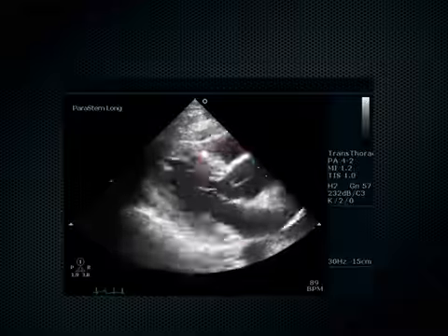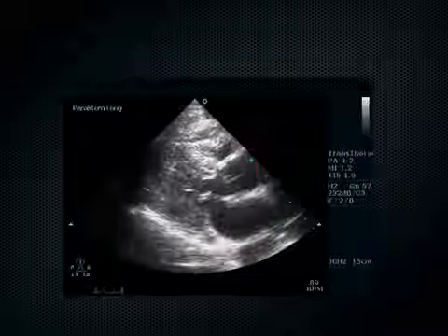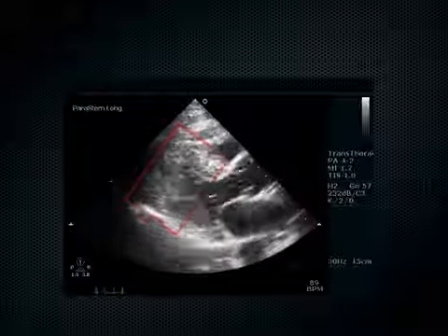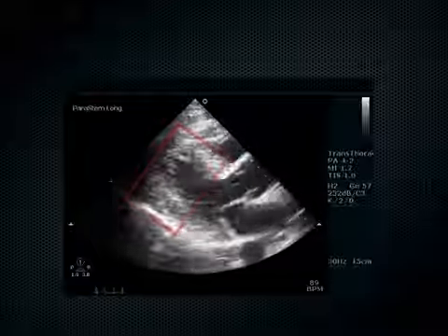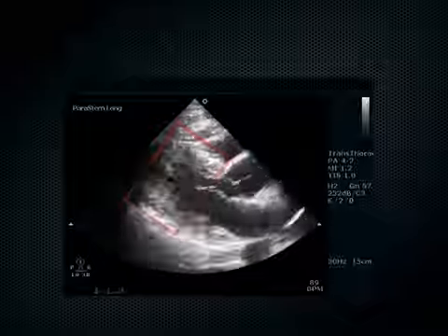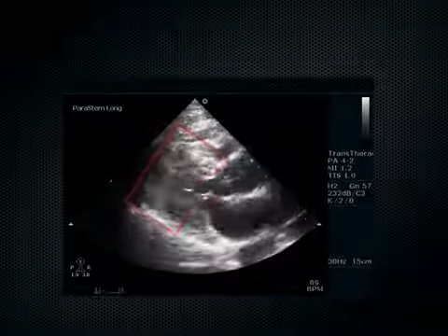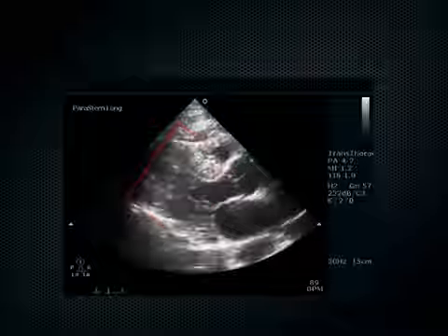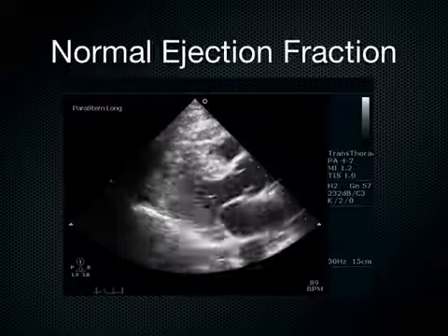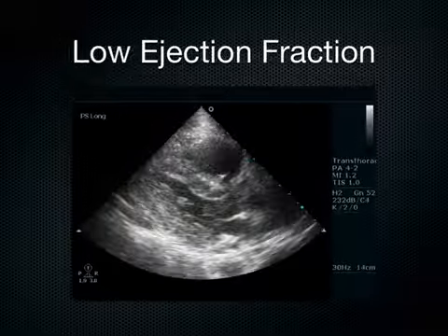Okay, septal leaflet coming up. Pretty good, hitting that septum pretty well. Okay, good sequentiality going on. How about the LV and the septum, interventricular septum? Yeah, the heart is emptying with each beat. See how they actually touch each other there. And when they touch each other like that, and this patient's blood pressure is 70, I know that I need to right away get some fluids going, right? This is a dry heart. It needs some fluids. A normal EF that's a very thirsty heart.